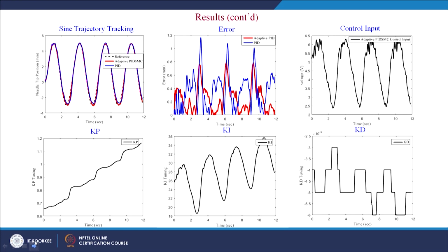And now we have also tested with a sinusoidal trajectory, so that the needle can take a continuous trajectory as shown here.